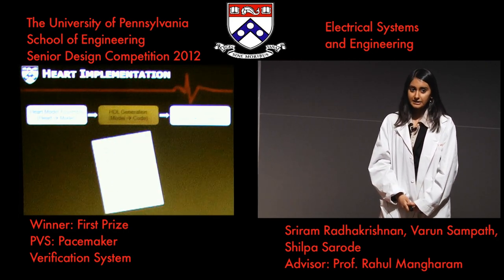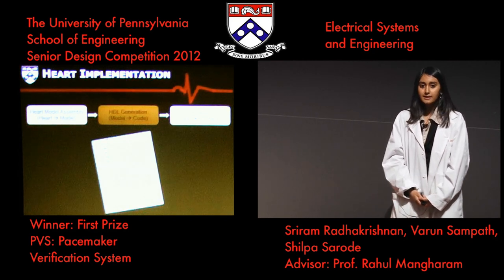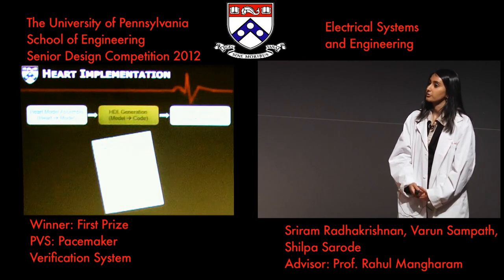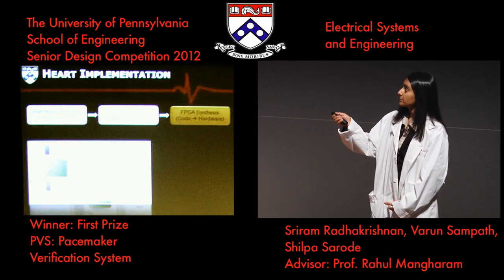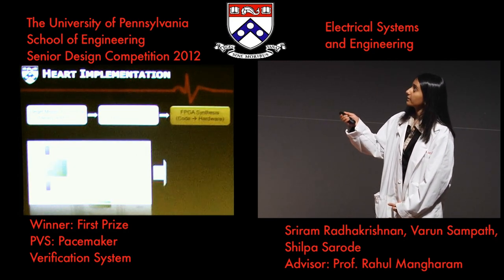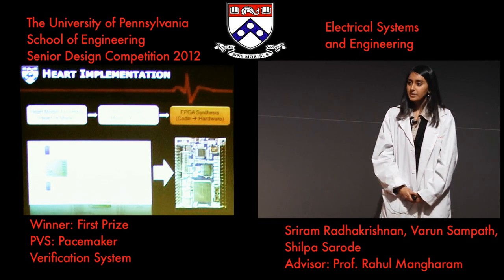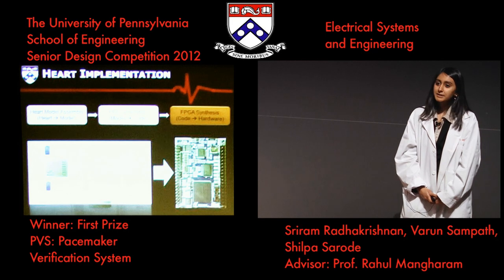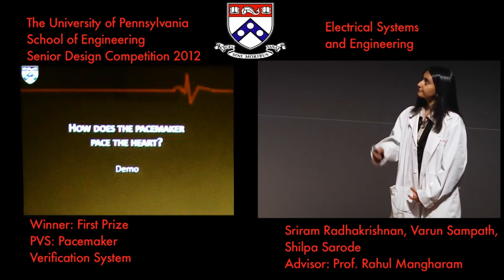The idea, then, is that by showing a previously known error, this endless loop tachycardia, we have shown that we can use different HDL models to perhaps even catch errors that haven't been caught before. HDL code, new algorithms like that code that you would put on the pacemaker, how do those affect the heart in terms of the feedback? It is actually the instructions model for the actual hardware that is implemented on a hardware program. The idea then is that we want to catch these bugs before patient implementation. Now that we have a virtual heart on hardware, close to a real one, we want to make sure that bugs aren't found when a patient is already implanted inside of you.